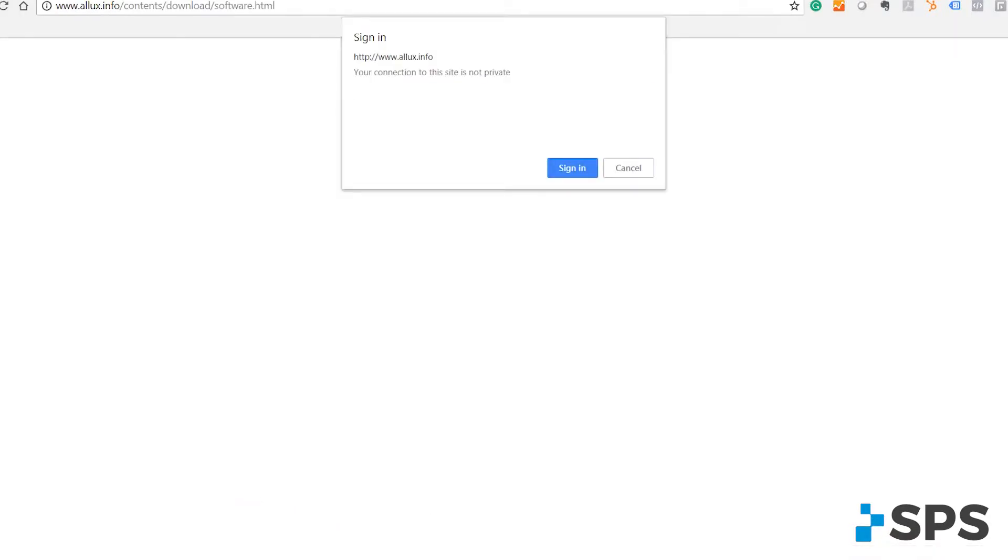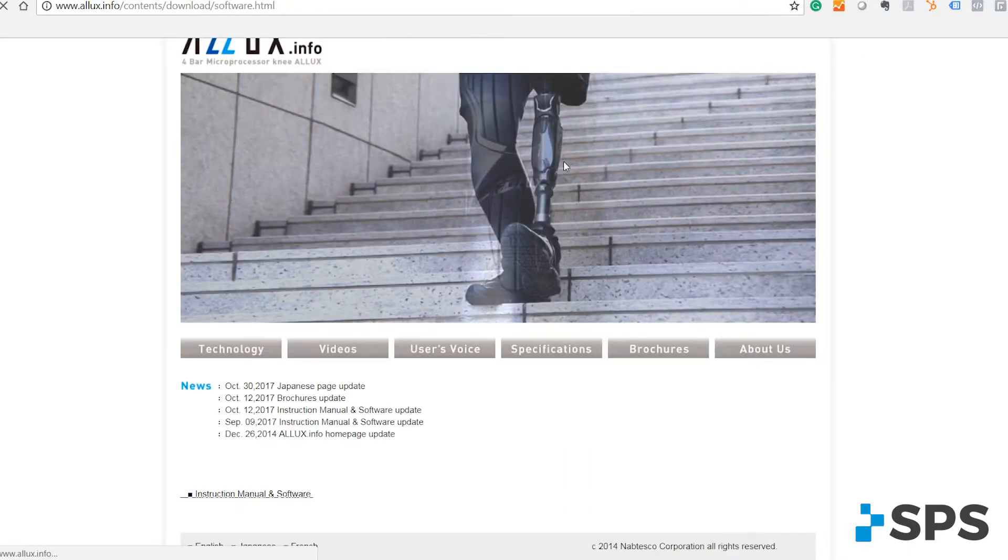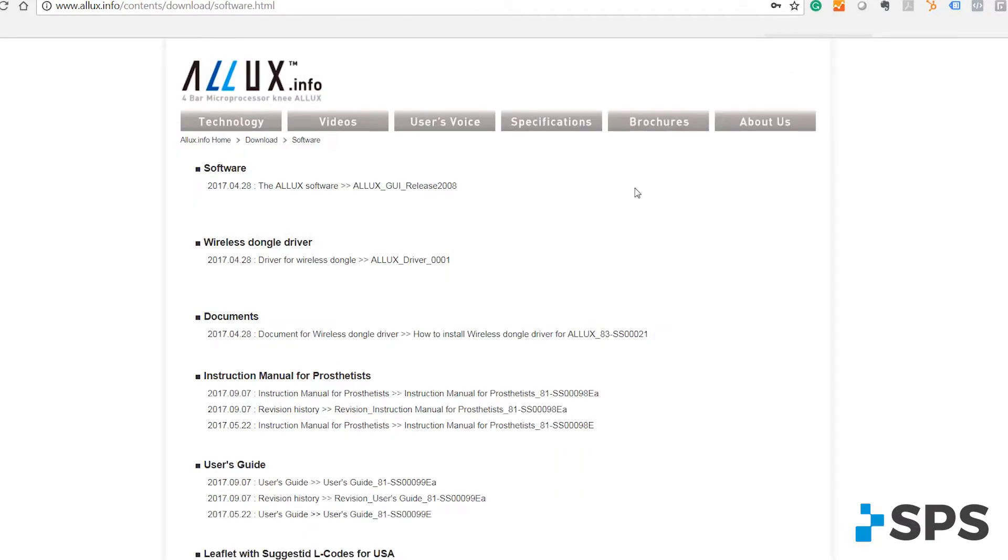You've got the username and password entered. You'll be able to download the software, the wireless dongle driver.